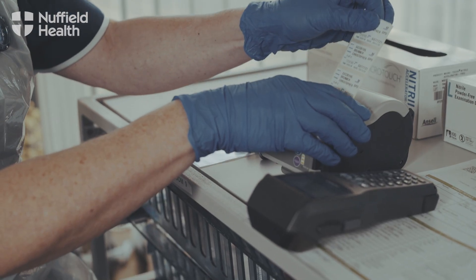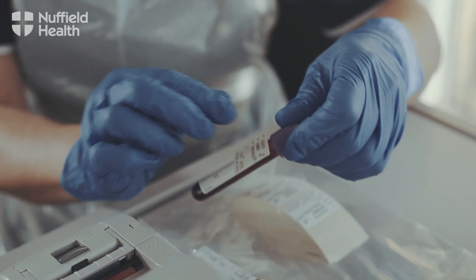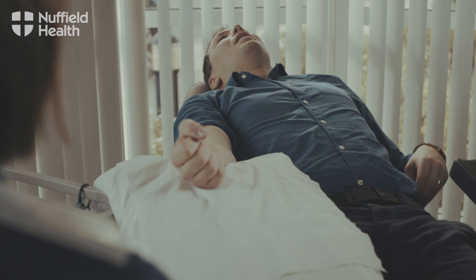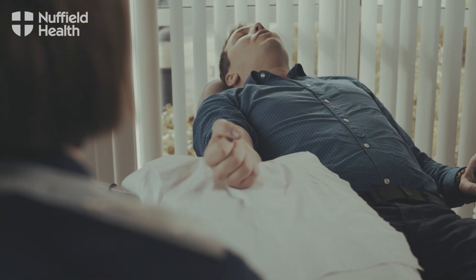If there are fears or anxieties associated with having any blood tests, you don't need to be embarrassed or worried about it. There are lots of ways we can make you feel more comfortable. We can lie the chair down so that you can't see what we're doing, and then if you feel faint you're already lying down. Obviously we talk to you all the way through to find out if you're having any problems. Most people find that it's not as bad as they thought it was going to be in the end, but if you do then we've got lots of ways to help you deal with it.